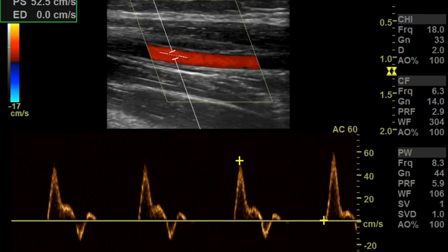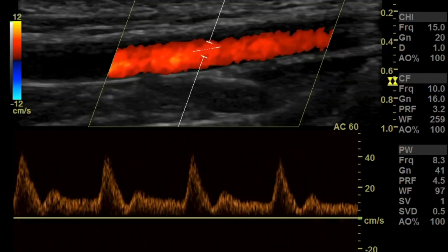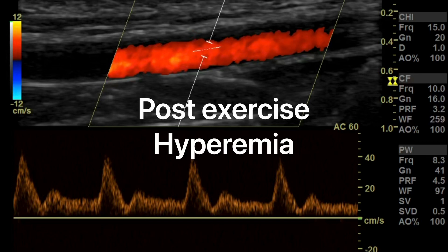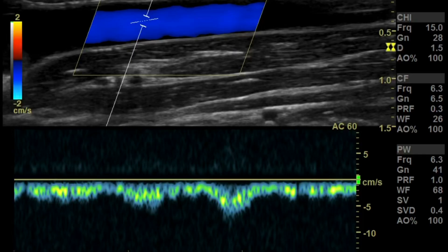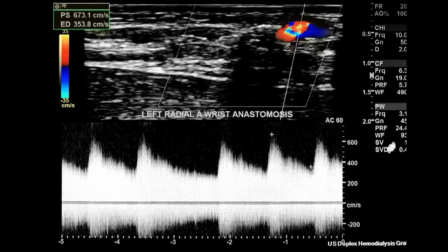The waveform in an upper extremity artery can be changed with either momentary ischemia or exercise to a monophasic or biphasic waveform with increased diastolic flow, which would be reactive or active hyperemia. The normal blood flow in an upper extremity vein is usually slightly phasic due to respiratory and/or cardiac pulsations. Distal augmentation can cause a sharp increase in velocity, with a return to baseline shortly upon release.